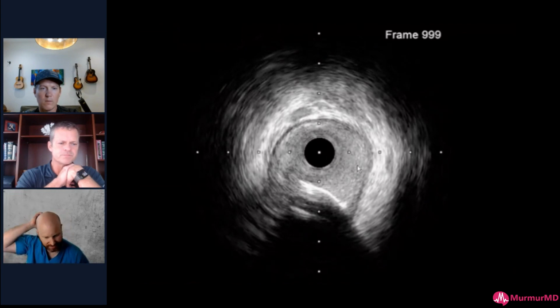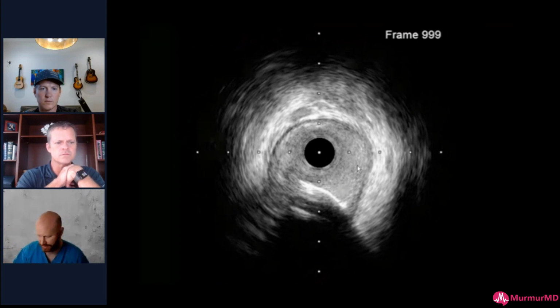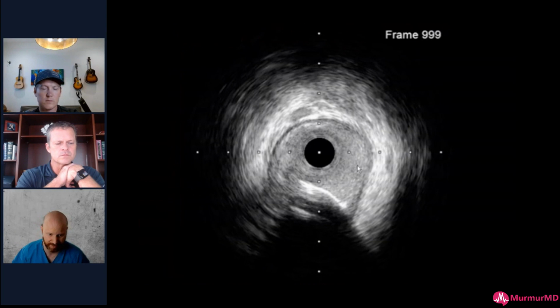You could take a 2.5 stent and deploy to high pressure if you're trying to save a step and not post dilate. I find that doesn't work as well as I used to think it does, and I've sort of reverted back to using the appropriate size stent to nominal pressure, and then just having a 1-to-1 sized NC that I can go to high pressure, 18 or 20 atmospheres if I want to post dilate. I think that probably works a little better than using the stent balloon of a slightly smaller stent to deploy it to 18 or so.